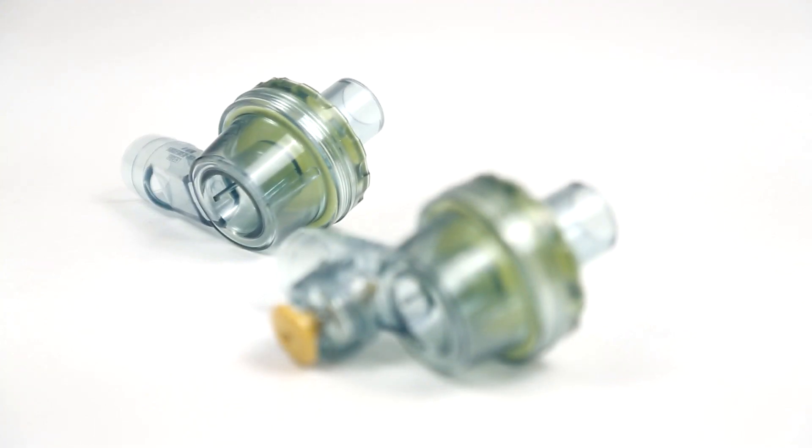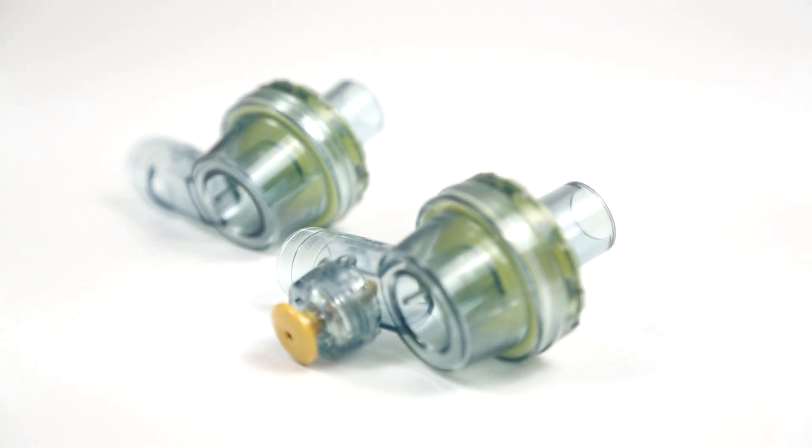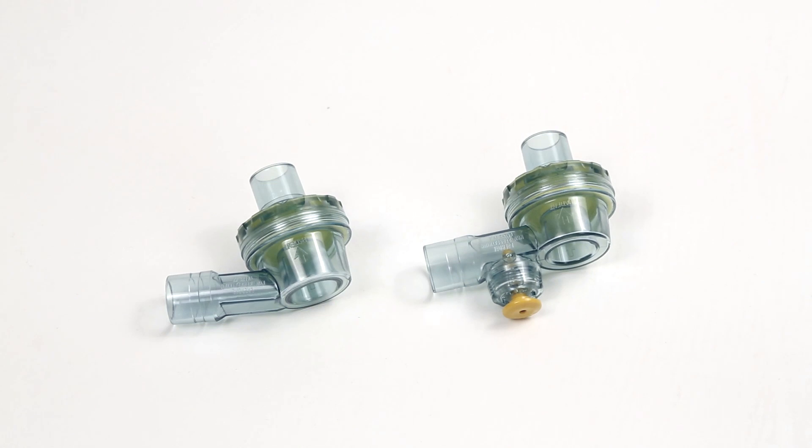The one-way patient valve allows inspiratory air into the patient and prevents expiratory air from returning back into the resuscitator. The swivel connector allows for ventilation in various positions.